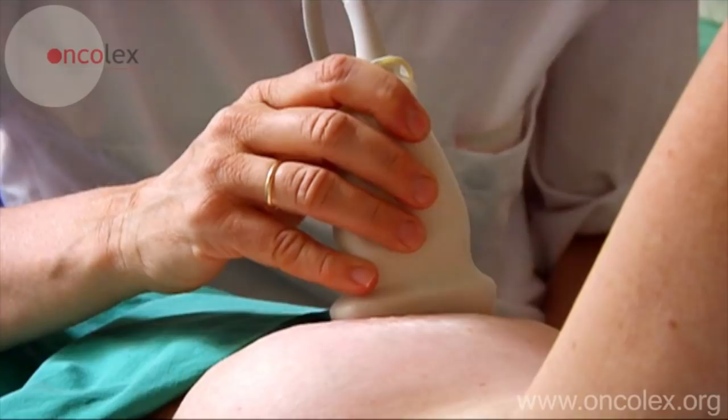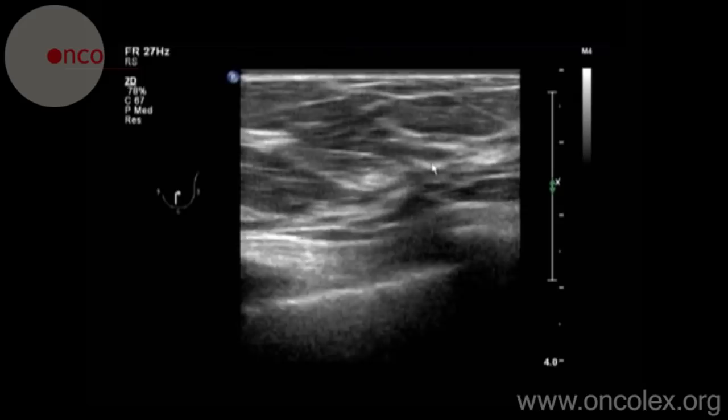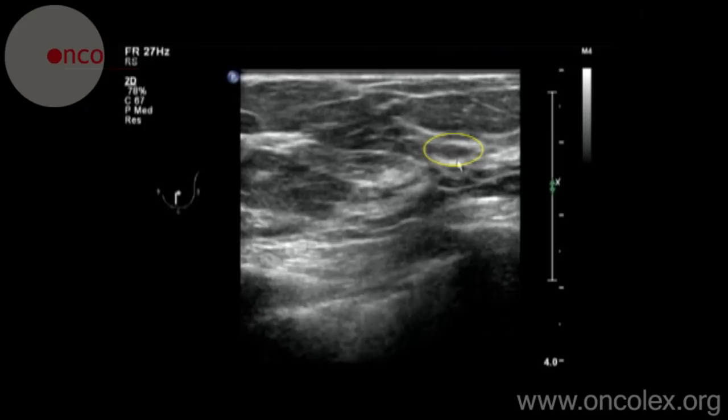This is a video of an ultrasound-guided fine needle biopsy. The lesion is localized using ultrasound. This is the lesion to be biopsied.